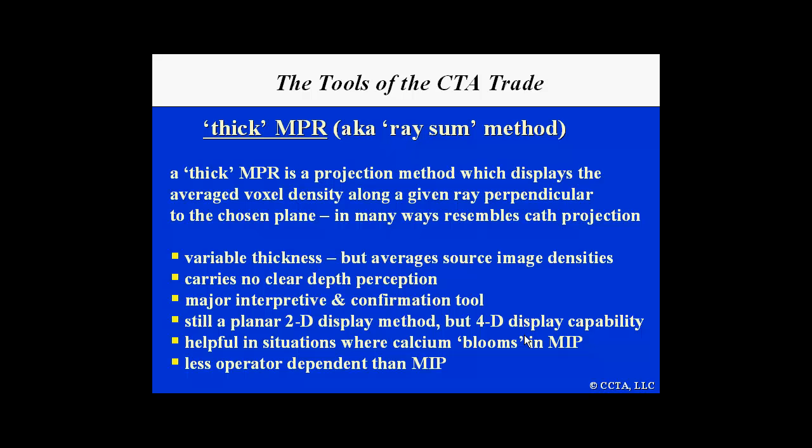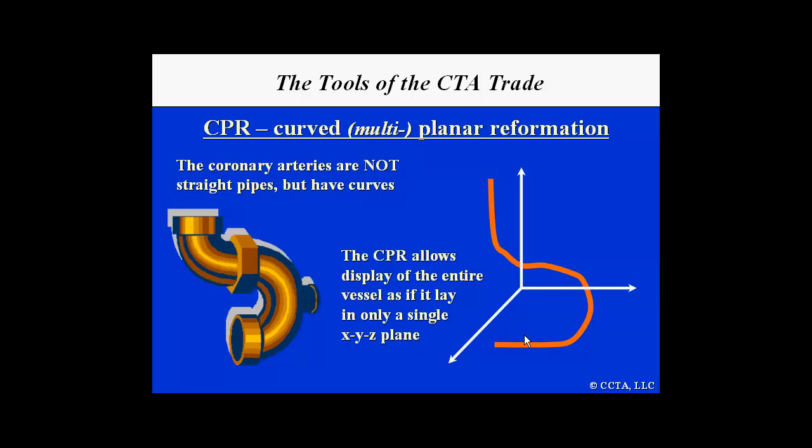It is still a major interpretive and confirmation tool. It is still a planar 2D display, but has 4D display capability. It's helpful again where calcium and stents bloom in a maximum intensity projection, and it appears to be less operator dependent than a maximum intensity projection.